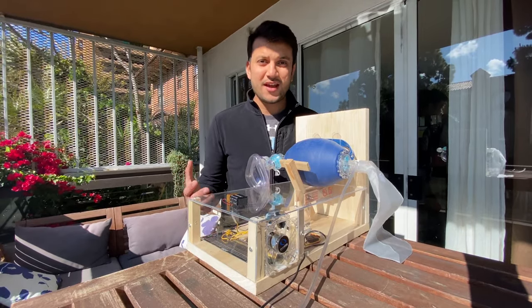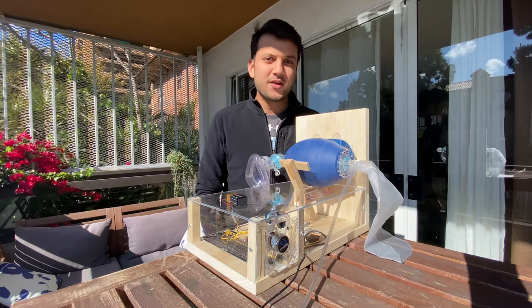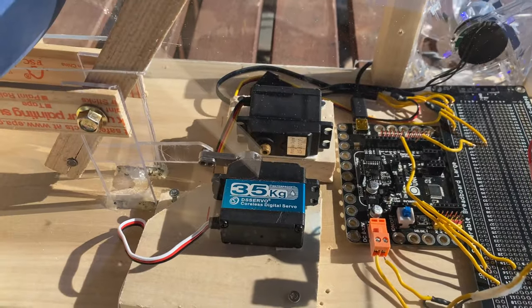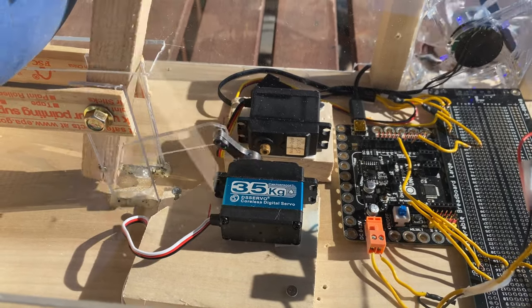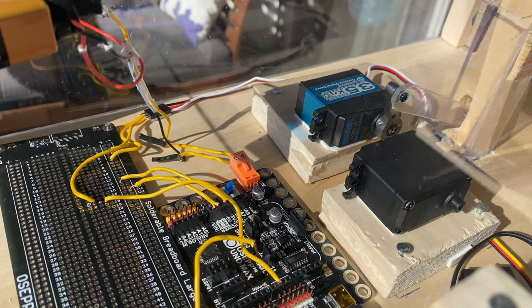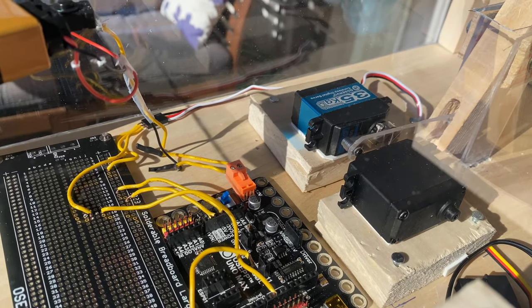What we've created here is essentially an add-on device to the bag valve mask. It will compress it according to the respiratory needs of the patient. It is powered with a DC servo motor hooked up to an Arduino circuit. This device can be operated with a 9-volt battery or with a mini USB cable, making it incredibly portable and easy to use in lower-resource settings.